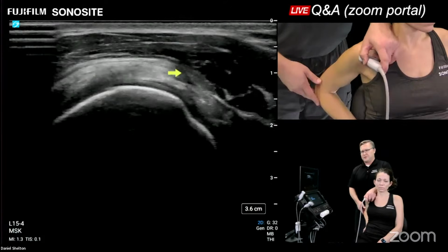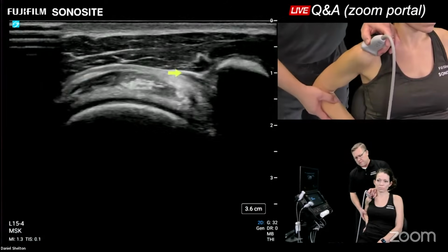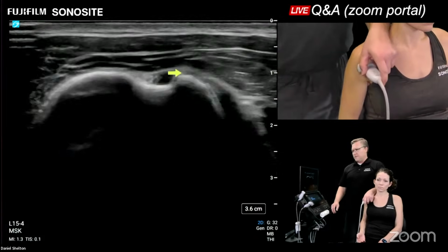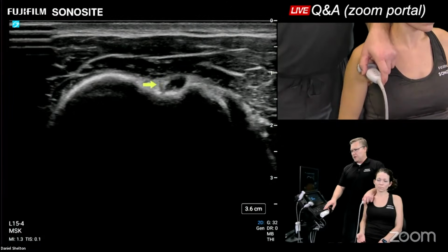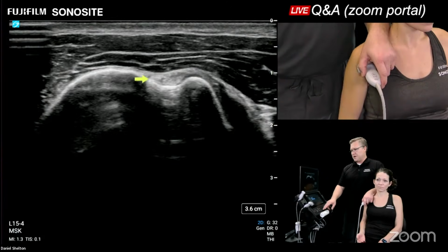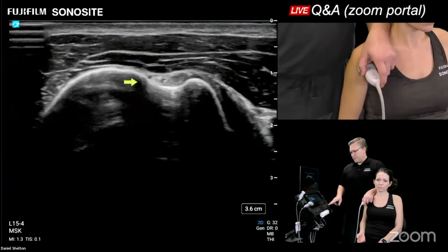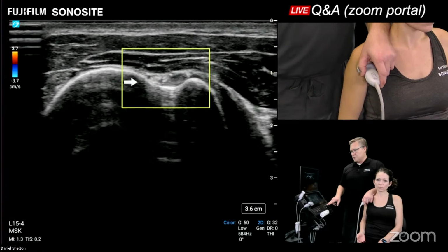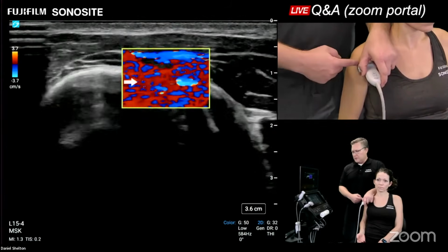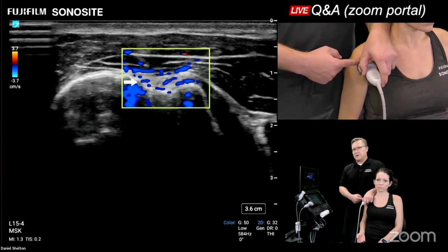Yeah, when you're guiding procedures in particular, and you want to stay away from things that are vascular, like if we were doing a biceps tendon sheath injection, right? And you wanted to stay away from those red things that are pulsating and going to cause bleeding into the sheath, which ultimately dump into the joint. And we know red blood cells are toxic to the joint. So we know there's an artery there. If I activate the color feature here, if I'm doing an injection and I'm guiding a needle, the tissue motion can set off the Doppler artifact or the color artifact.